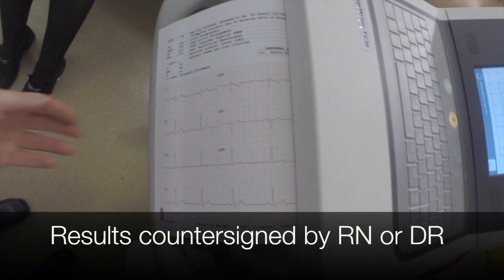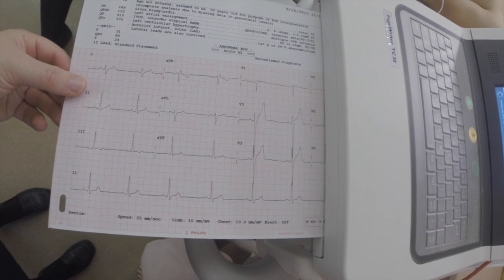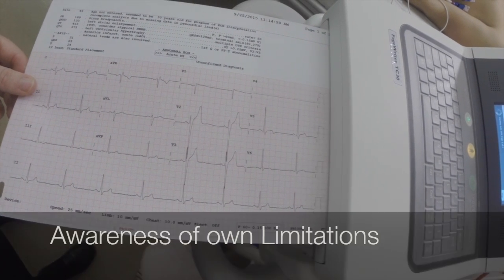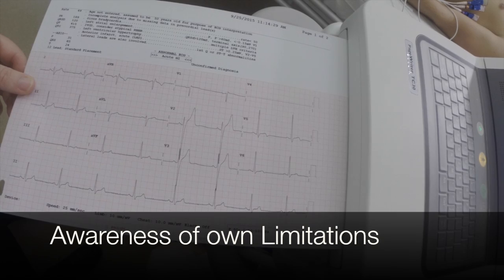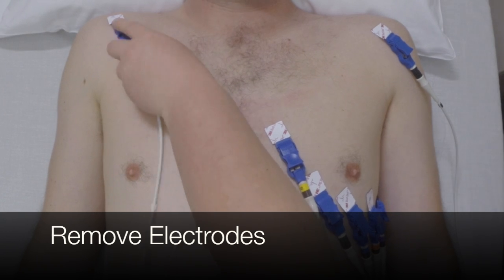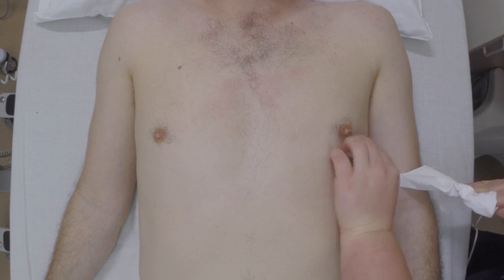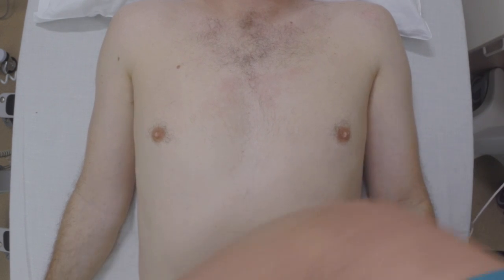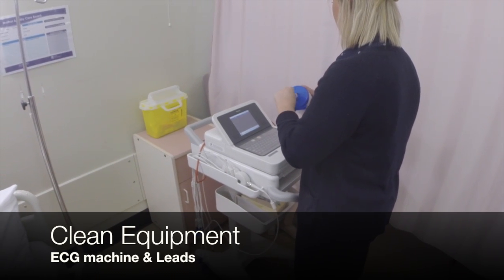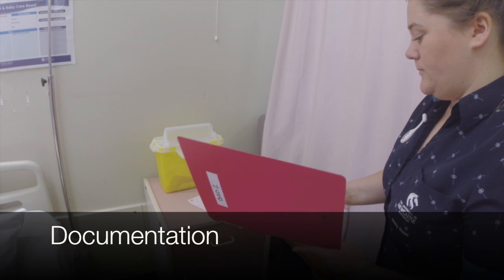After each tracing is taken, the results should be shown to an experienced registered nurse or doctor. Lack of experience and inability in interpreting an ECG recording might lead to overlooking significant changes. Knowledge of one's own limitations is demonstrated by consulting with someone more experienced. Following the procedure, remove the electrodes and wipe off the conduction gel to increase patient comfort. Assist the patient to a more comfortable position and inform the patient that the procedure has concluded and results will be analysed. Clean the ECG machine and its leads and ensure the machine is ready to go if required in an emergency situation.